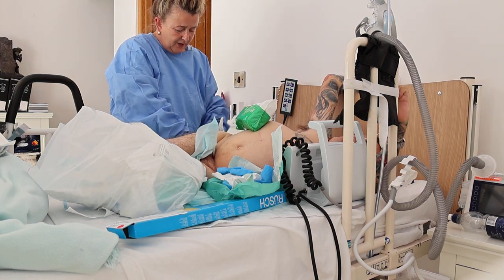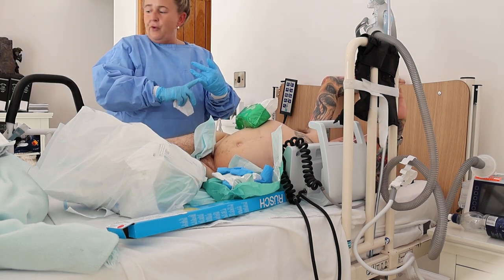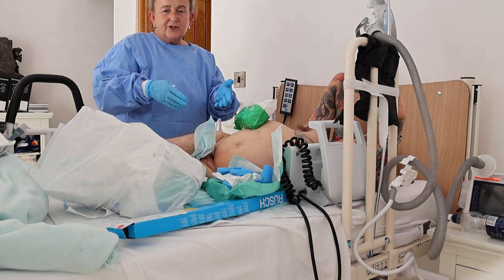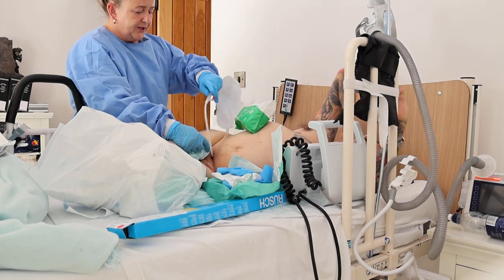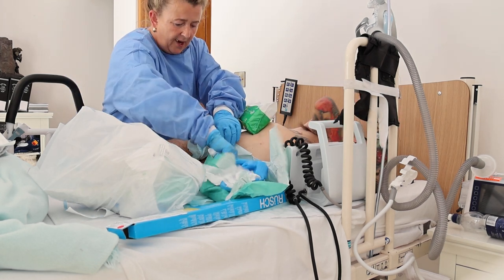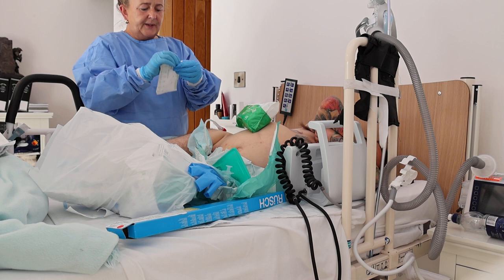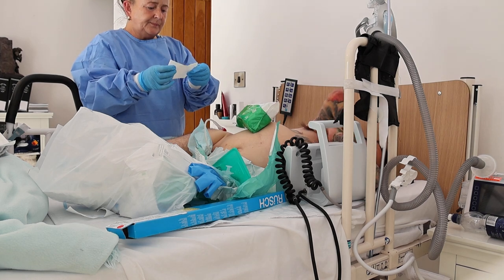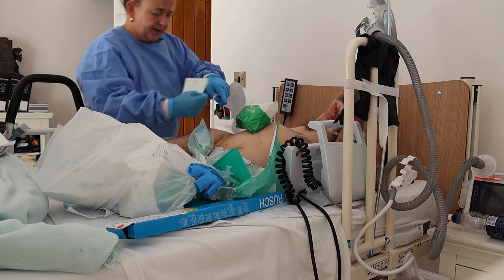So if anyone has any problems with suprapubic catheters, and they are double incontinent, then forget going in with your basic bladder washes or X, Y, and Z. The best thing to do is measure. This is a little tip. From your stoma to the nozzle there, I'll show you what I use. In the catheter pack, you have these. I use it to measure how far that catheter is in, so that we know on a daily basis.